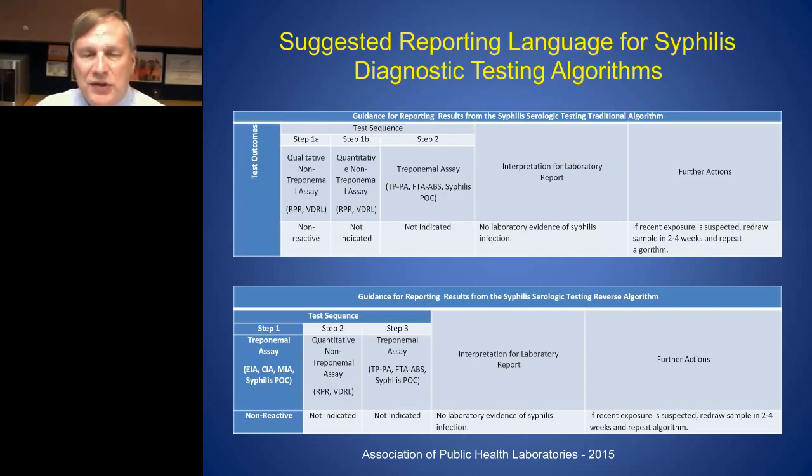So it'll cover all the standards as well as some of the rare or unusual interpretations and further actions. So it'll be a very good document and certainly very timely. We also have the reverse algorithm that you can see on the bottom. And again, it's just the top row because this hasn't been finalized yet, but these non-reactive are pretty straightforward.